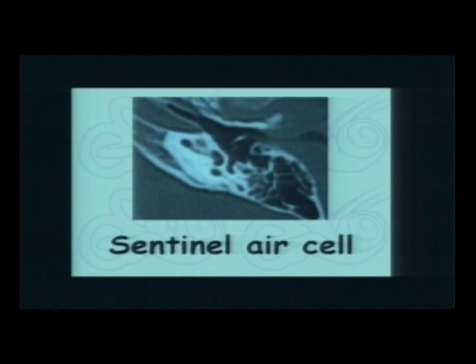And this is a very nice surgery, because once you open this side of the cell, you see that the other side already is in the middle ear, and you see that you've performed your first posterior tympanotomy. Actually, you didn't perform it. God gave you a very nice air cell there called a sentinel air cell. You're all happy when you get temporal bones with sentinel air cells.